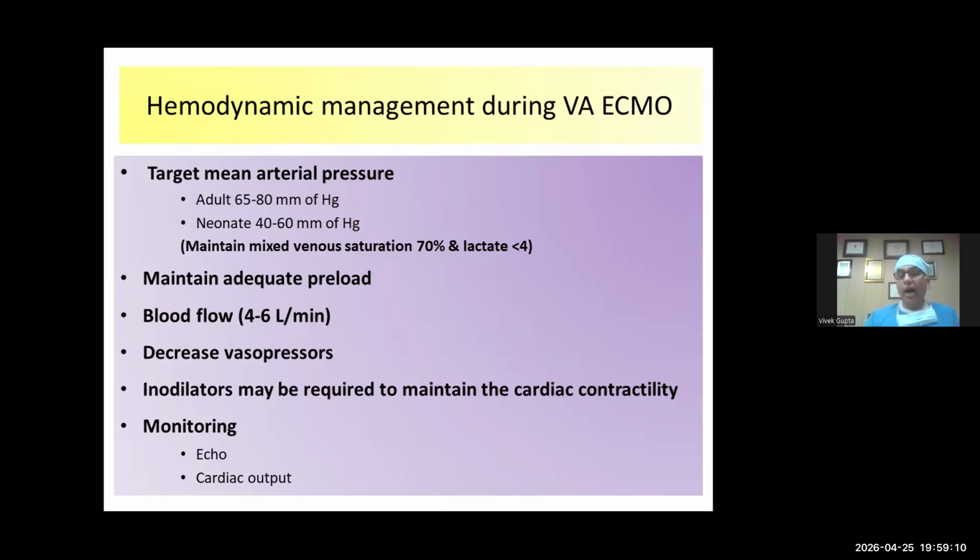You may need an inodilator to ensure cardiac contractility. You look at a regular echo, and it's not necessarily a cardiologist; you must be trained as an ECMO physician to do the basic echo so that you can understand and look at the cardiac function.